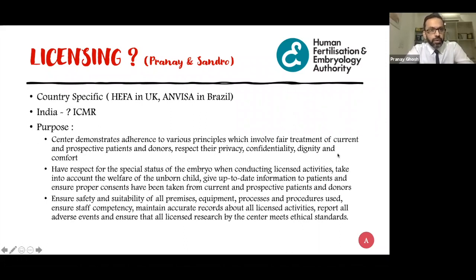But if you talk about the VOC monitoring, the BCTD is a lot more stringent in saying that with all the ventilations, they need to have activated carbon filter. And they are, in fact, a lot more stringent with regards to the requirement of the post filter and the pre filter. So these stringencies are not observed in the guidelines that we are having here under the ICMR.